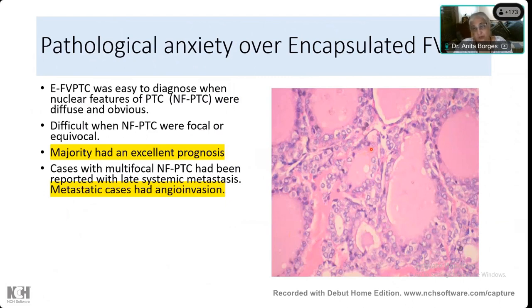And I don't think every part of this tumor showed this; this was just one area. In other words, this looked like a thyroid adenoma, but it had a capsule, it had everything. So what should we call this particular thing?